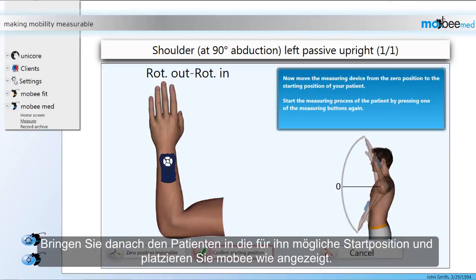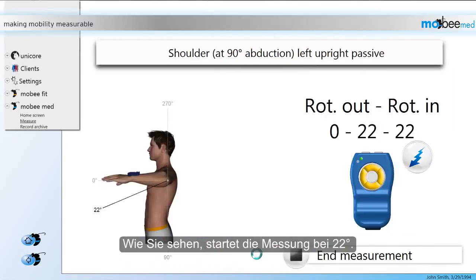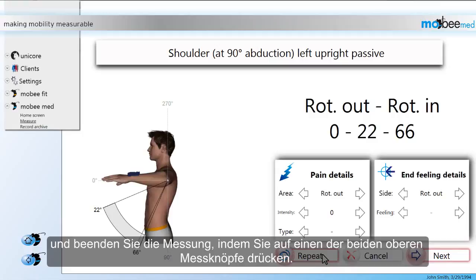Afterwards, bring the patient into the starting position possible for him and place Mobi on the patient as indicated by the software. Finally, confirm the starting position by pressing one of the measuring buttons on top of the device. As you can see, the measurement starts at 22 degrees. Now you can guide the patient through the movement and end the measurement by pressing one of the measuring buttons on top of the device.